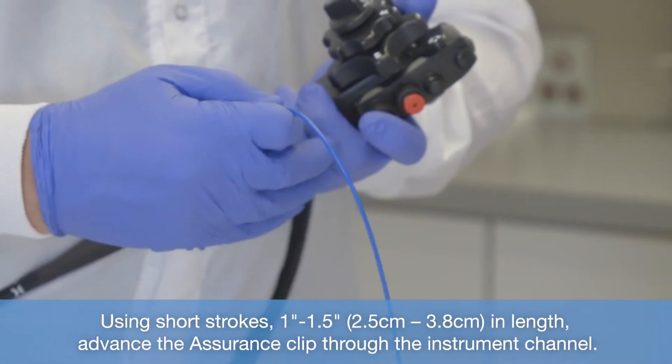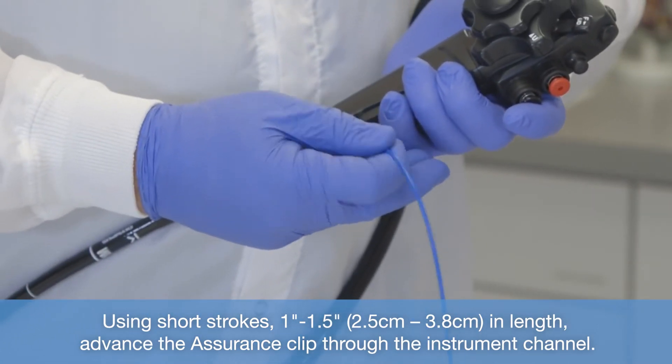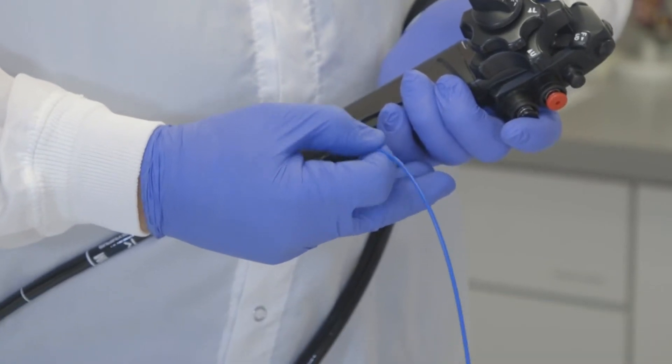Using short strokes, 1 to 1.5 inches or 2.5 to 3.8 centimeters in length, advance the assurance clip through the instrument channel.